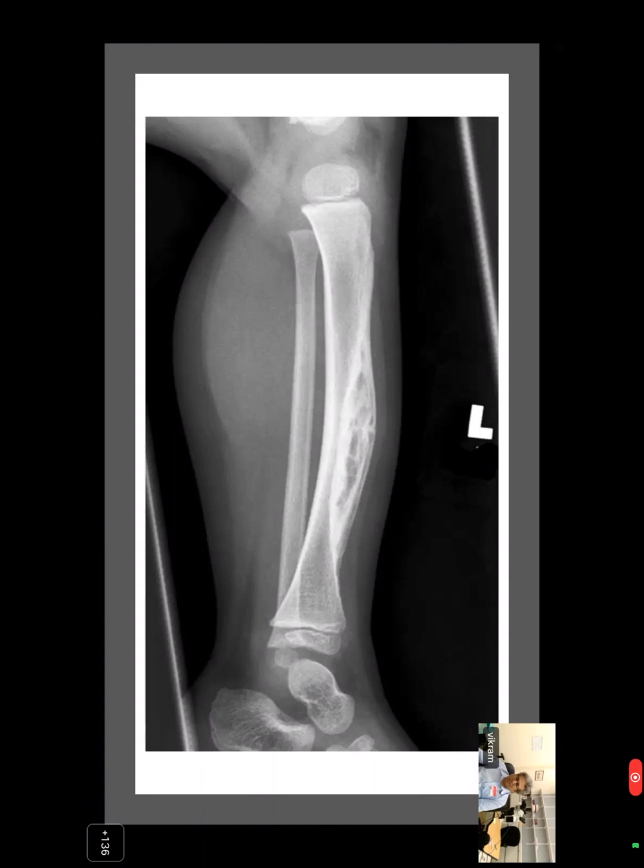And forget these notes. I'm not sure what I'm trying to correlate this with. I do have whole slide scans of these cases, and maybe I'll send that link across to you guys so you can see the entire case as well after this conference.